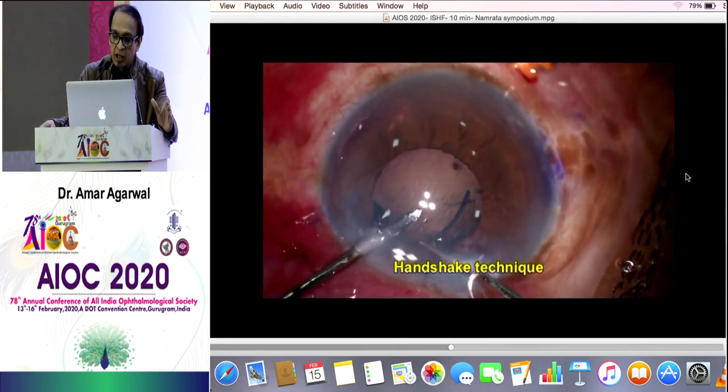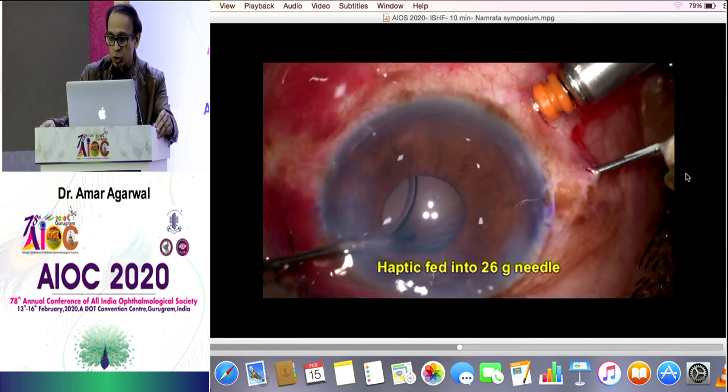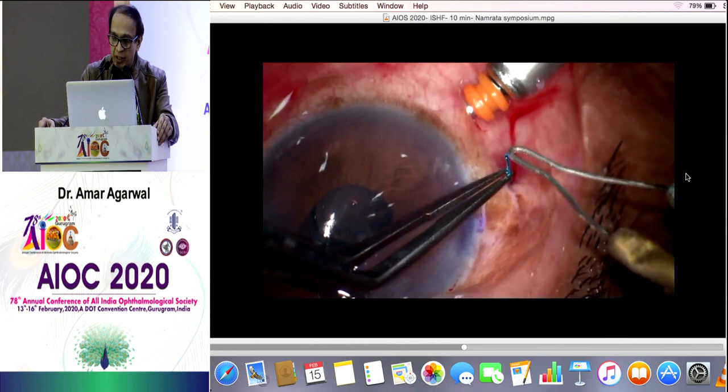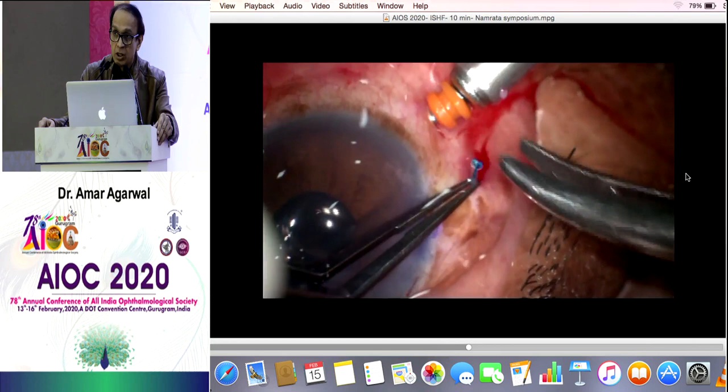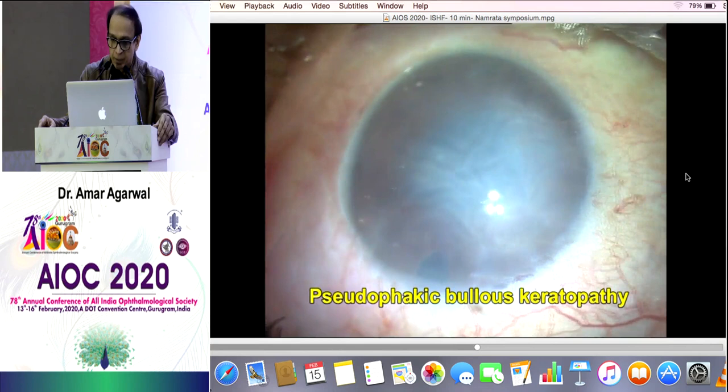So the advantage of the handshake technique now is, I pass my needle inside and I lock it inside there. So the advantage here is you don't have both the needles inside the eye, which I think is dangerous for the retina. Once I've brought it out, I've created my flange. Now watch, create the rivet. That will make it broader so that the haptic will not go down. Saying that, if you want to do the Shin technique, it's a great technique. I don't do it because, compared to the glued IOL, to be honest, I see more of a tilt in this. Now let's take this difficulty to the next level.